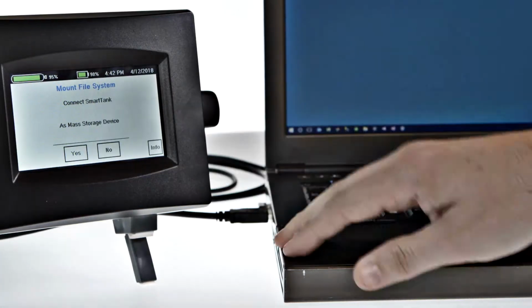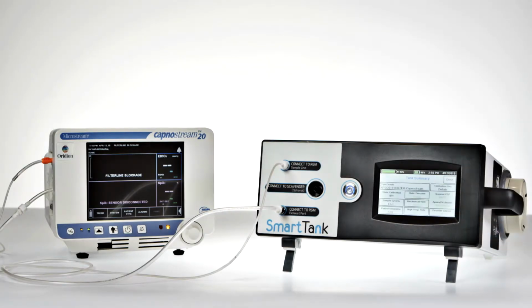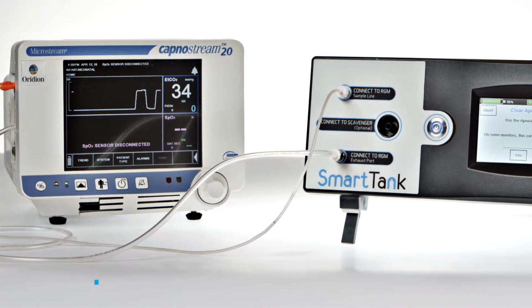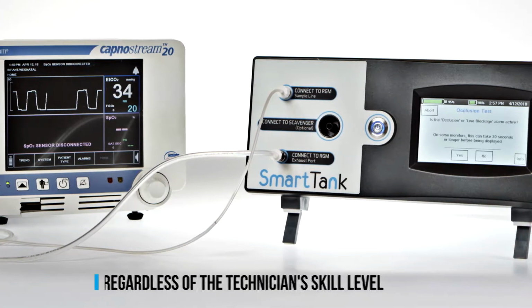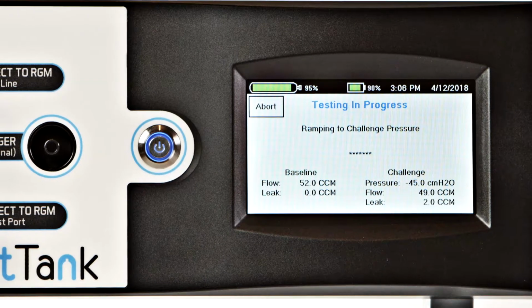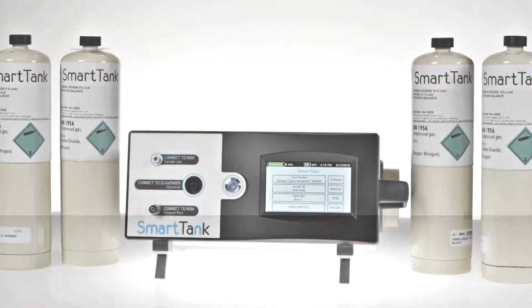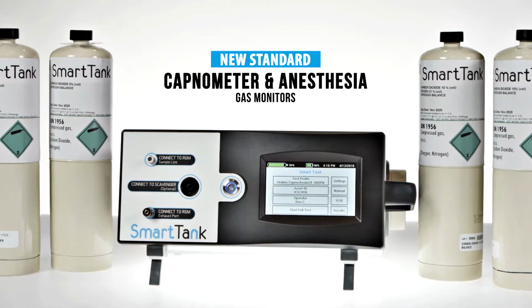You can download your test reports using a computer now, or move on to the next gas monitor that needs testing and download all the reports at the end of the day. For most gas monitors, this full test can be completed in under 4 minutes by any technician regardless of their skill level. And while fast and easy to use, the SmartTank still delivers superior testing which simulates real-world conditions and can detect all common gas monitor failure modes, even those missed by traditional testing methods. The SmartTank is the new standard in capnometer and anesthesia gas monitor testing and certification.